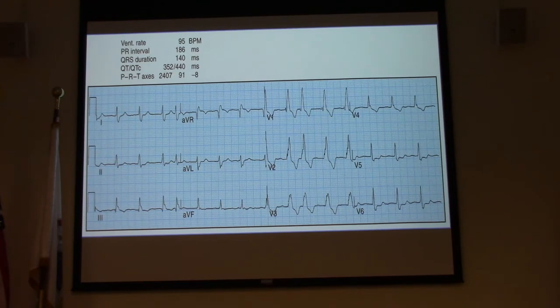Now it's up to us to make the determination, is it right or left? The easiest way to determine a bundle branch block after you see that this is greater than 120 is to look at lead V1. If I'm driving a car and I want to use my blinker to make a right-hand turn, I push my blinker up.